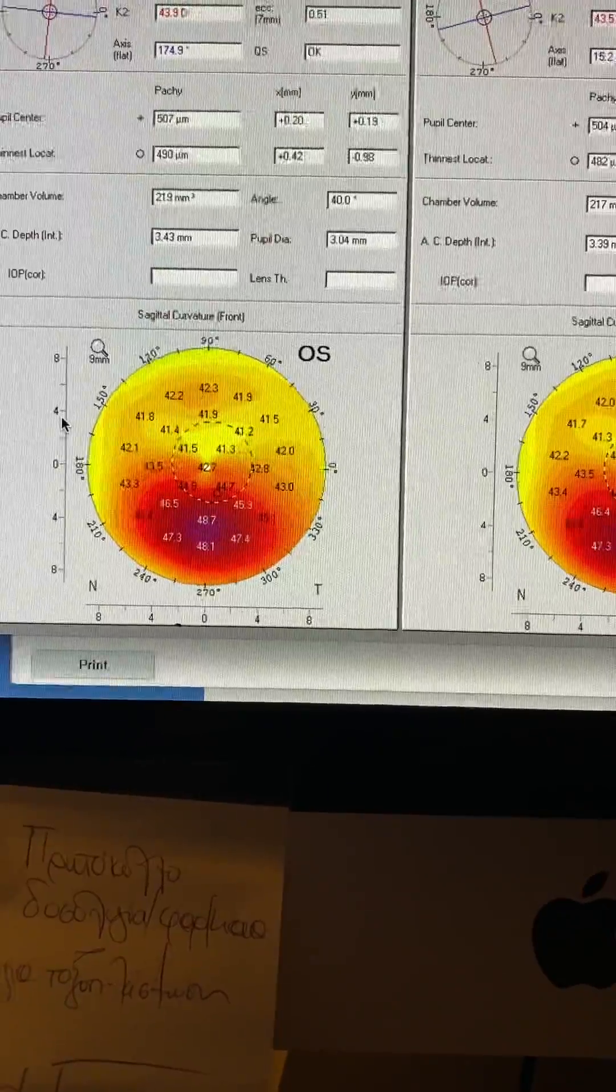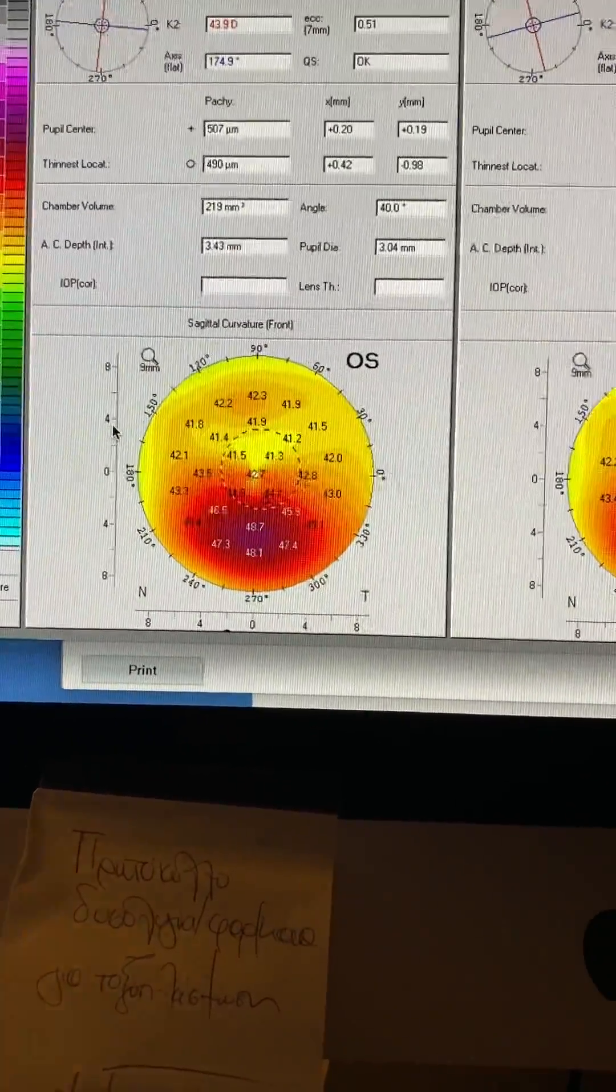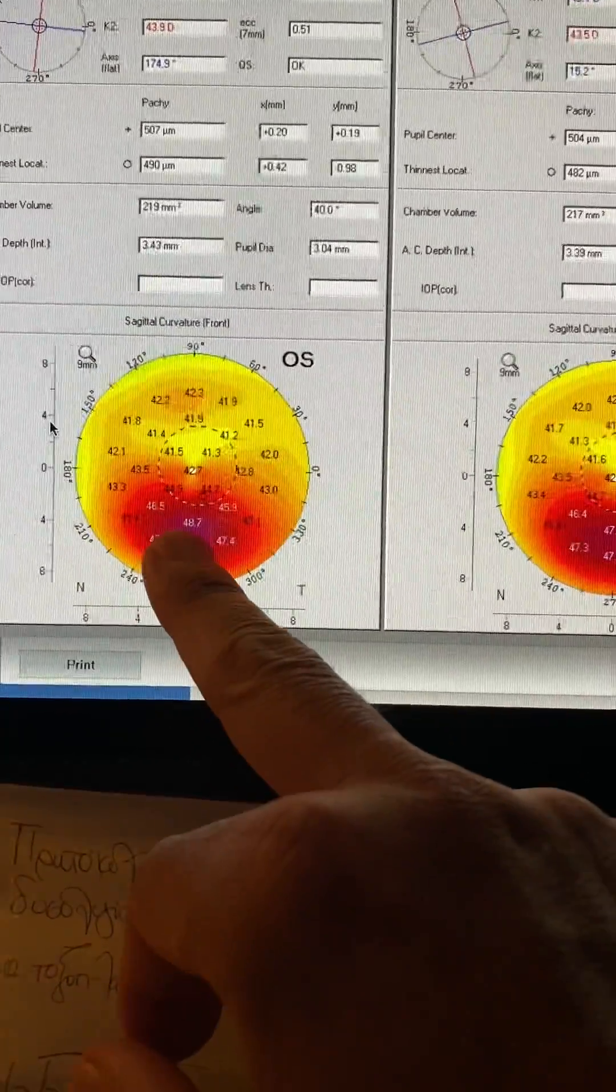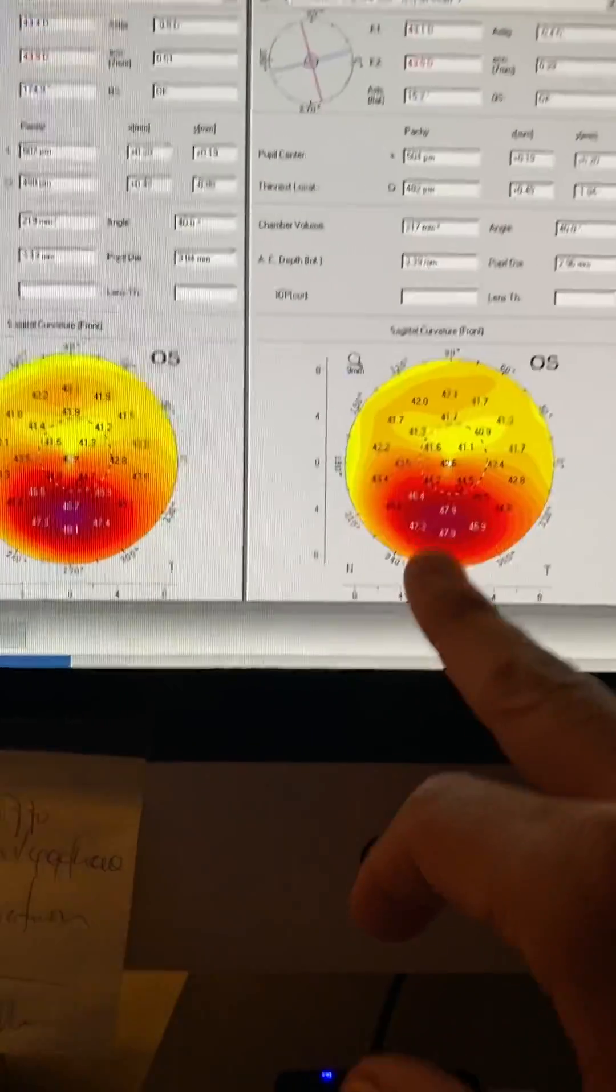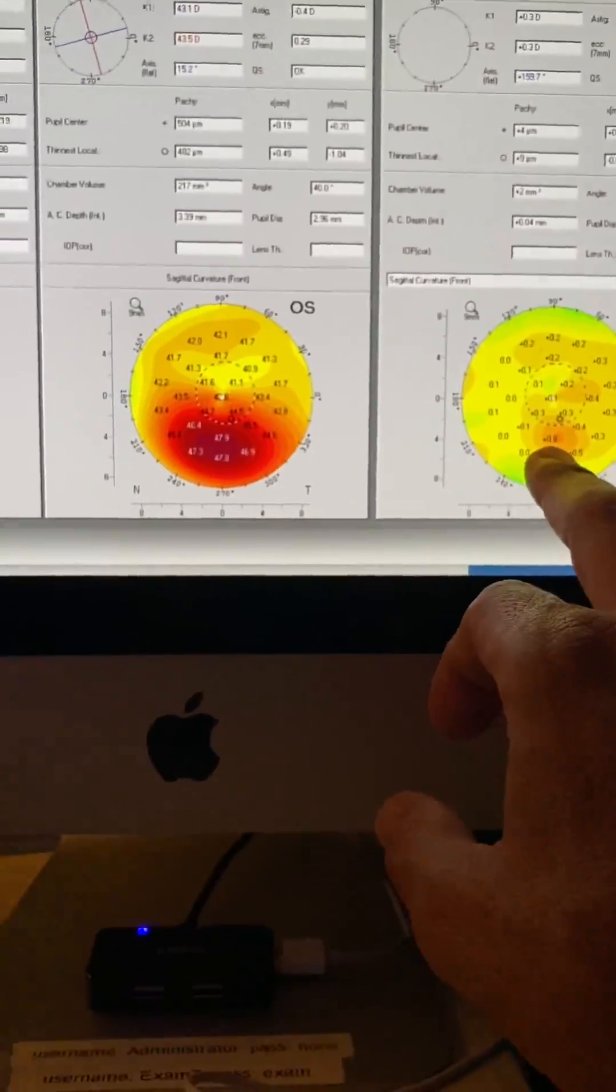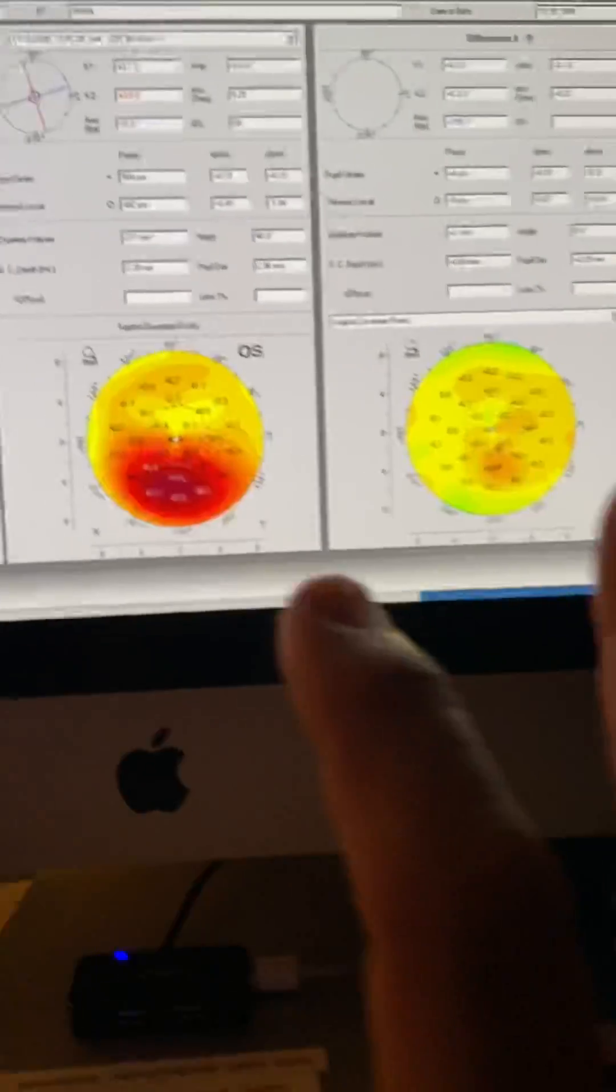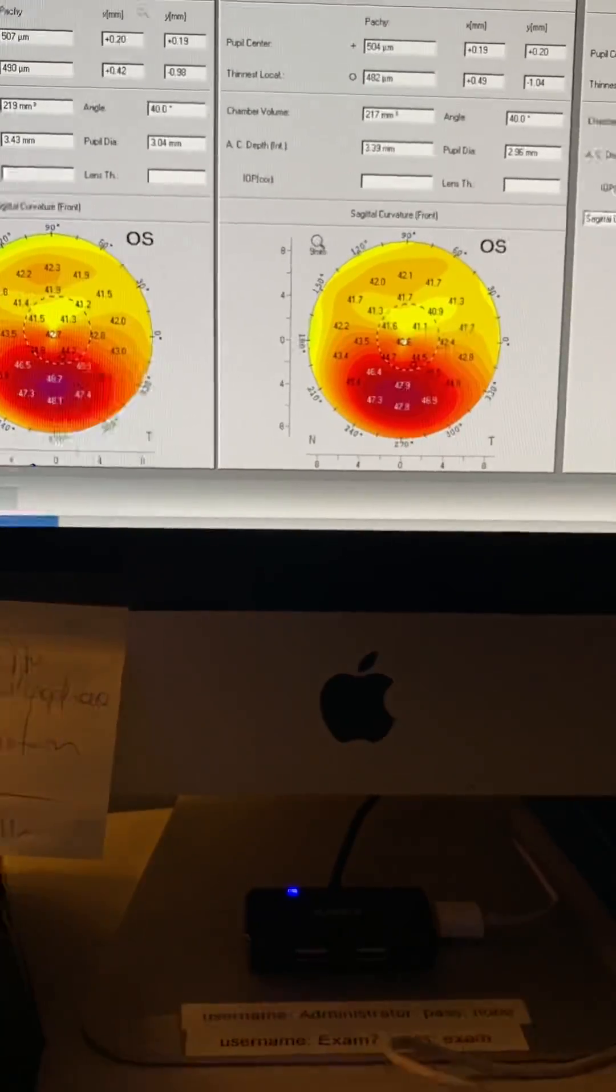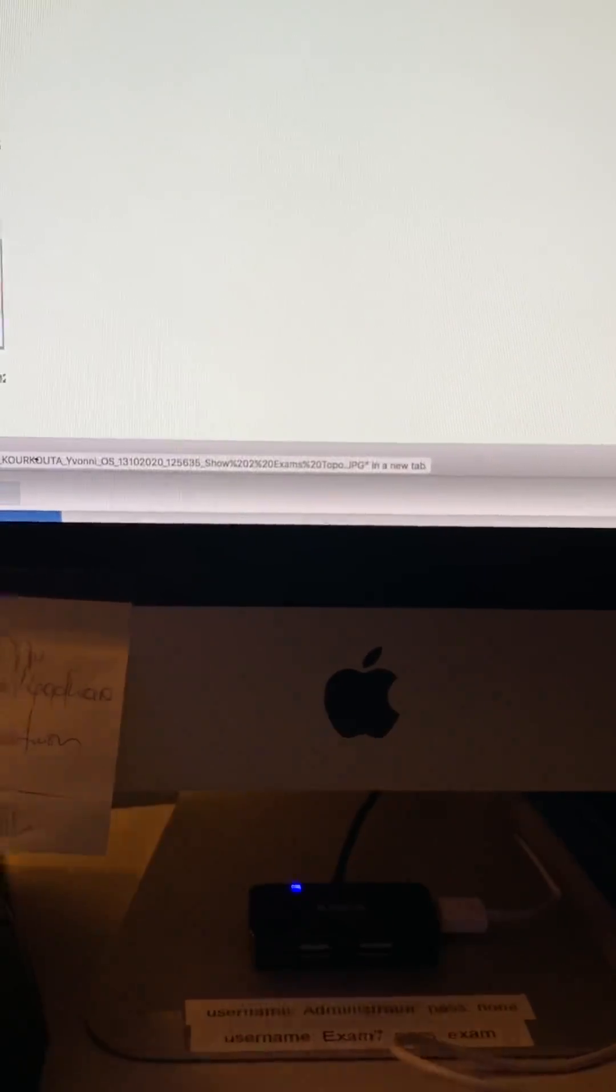This is her left eye in September of 19. So this is just a year ago. Her age to be a little bit more precise is 22. So she's a young lady. We were at 48.7, we're at 47.9. So no real difference. The actual cornea looks improved by 0.8 diopters. And this is with using one of the most precise instruments known in cornea, Scheimpflug tomography.